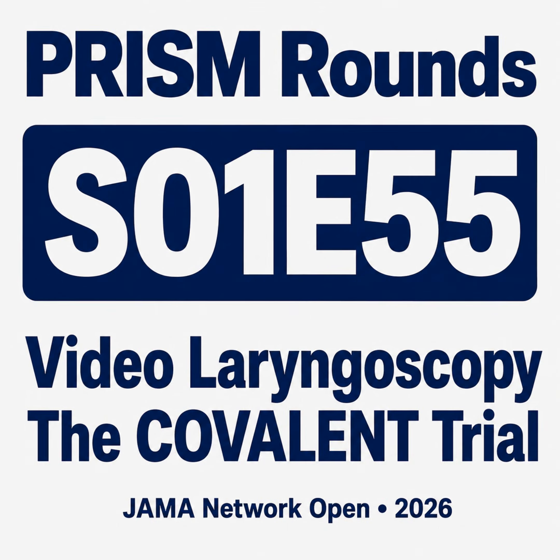Thanks for listening. COVALENT is especially relevant to ICU physicians because it builds on the DEVICE trial. DEVICE showed that video laryngoscopy improved first-pass success during emergency intubation of critically ill adults. COVALENT extends that signal into the operating room and goes a step further by comparing Macintosh style and hyperangulated video blades. Together, the studies suggest the conversation is moving beyond simply video versus direct, toward which video strategy works best, with which blade and adjuncts in which clinical setting.